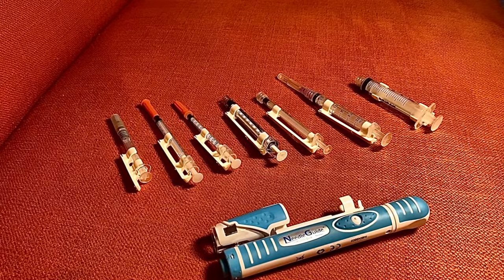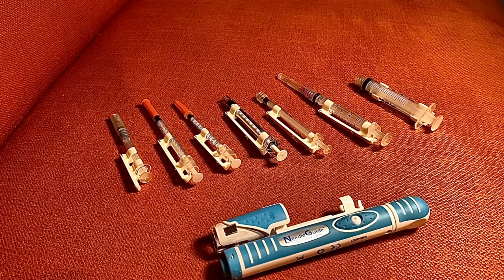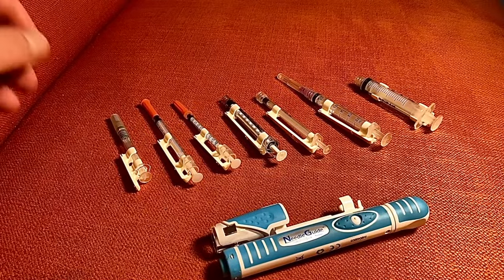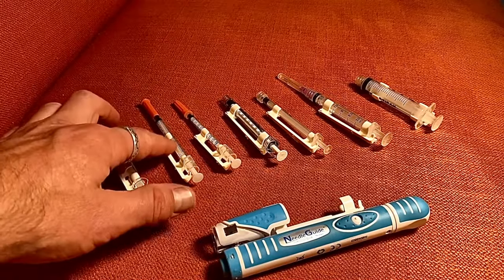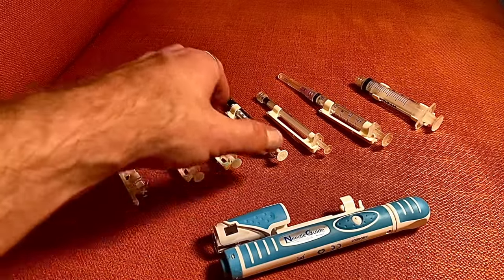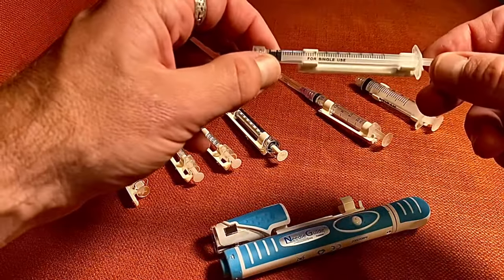This holds most universally accepted and common syringes on the market, ranging from about a quarter inch in needle length all the way up to an inch and a half, or 40 millimeters. We have a one mil glass BD syringe, a one mil insulin syringe, a half mil insulin syringe, and a one mil BD Becton Dickinson syringe.